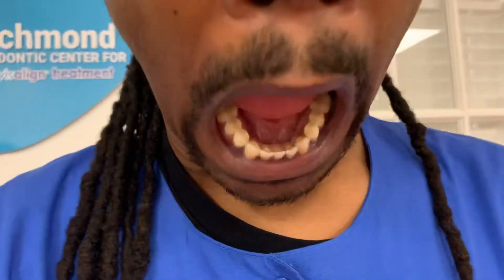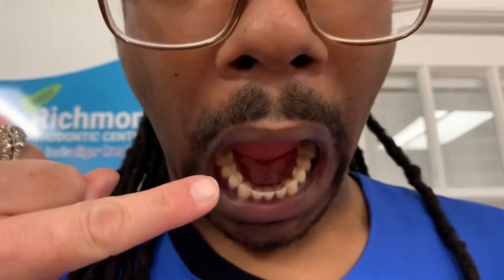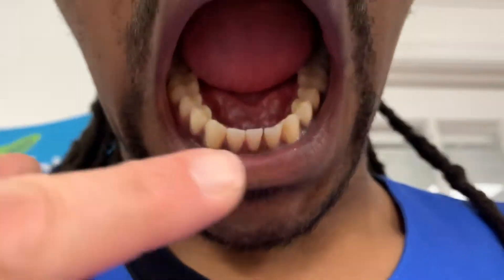Last one is the bottom. Kind of tip your chin down like Zach is, and come a little bit closer. That's perfect — just like that. You can see the molar and then all the way around.